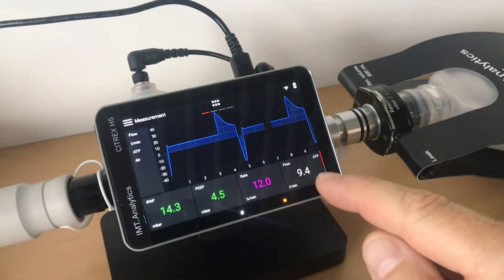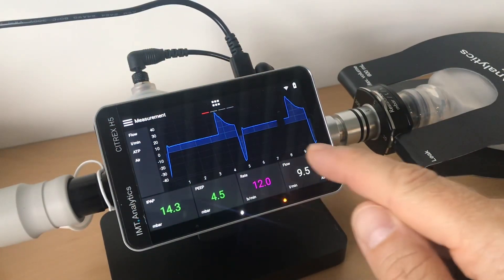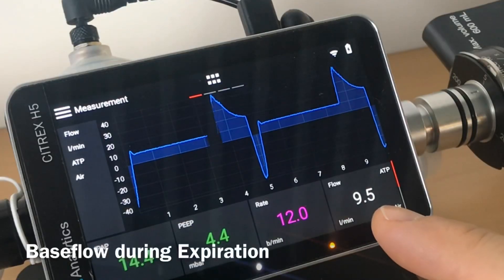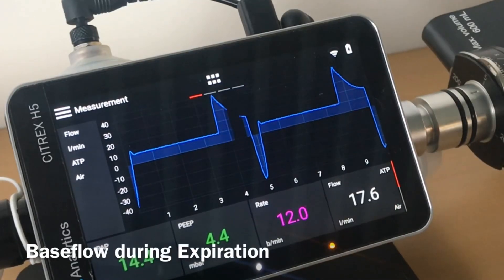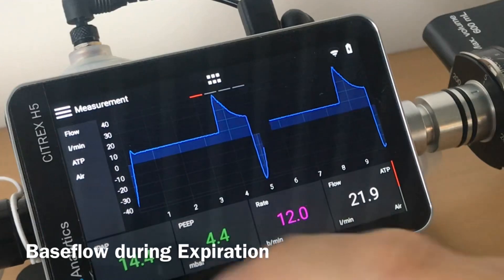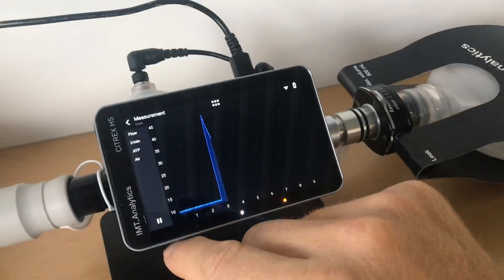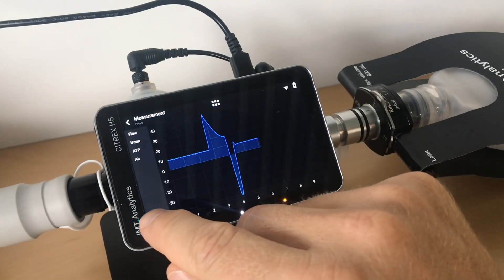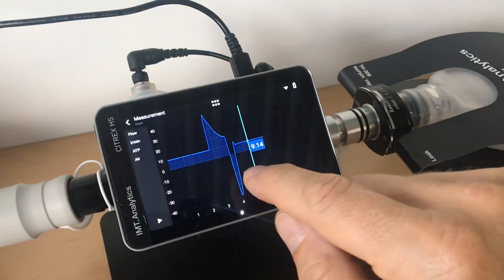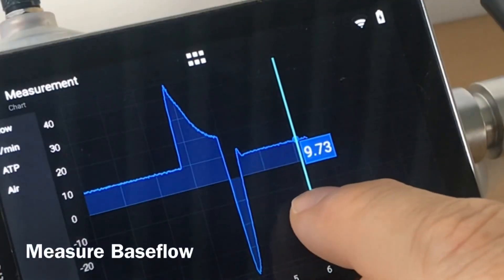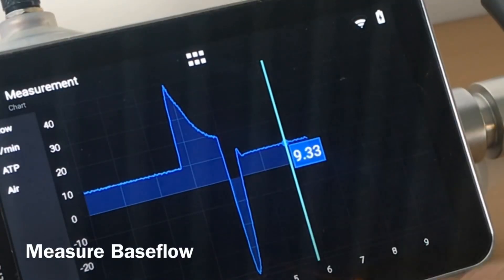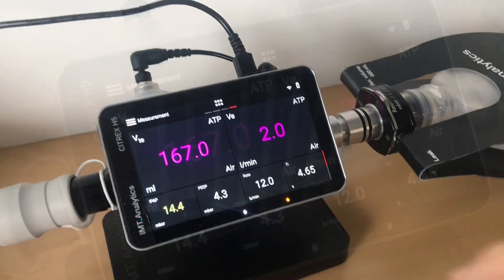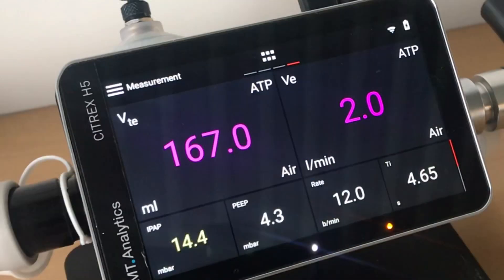But as you can see here on the Citrex H5, the flow measurement shows a base flow during exhalation, and this base flow has to be compensated for inspiratory and expiratory volume measurement.